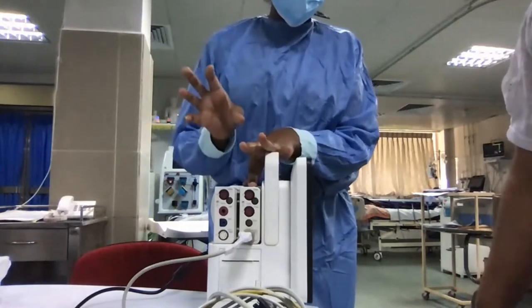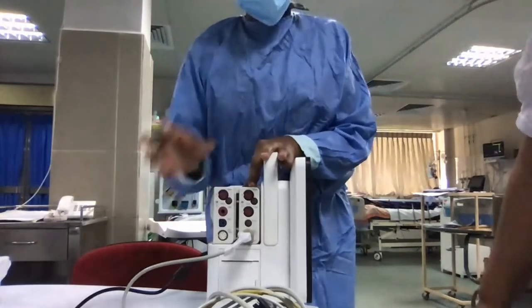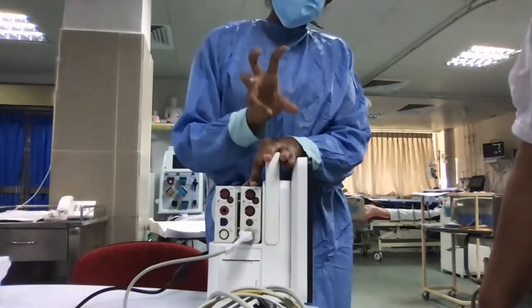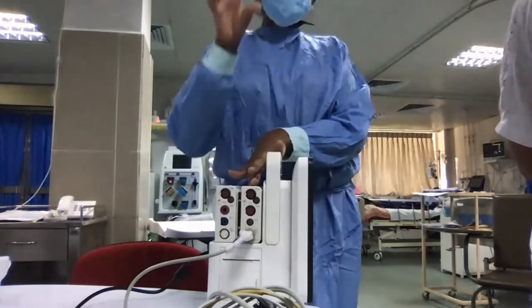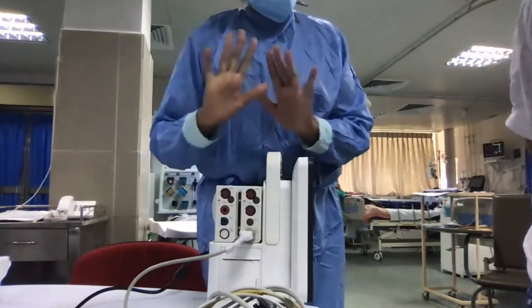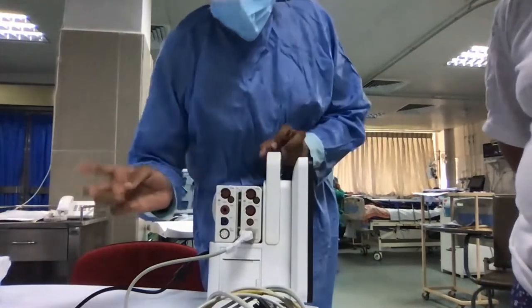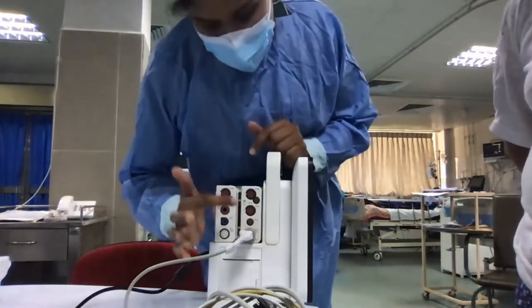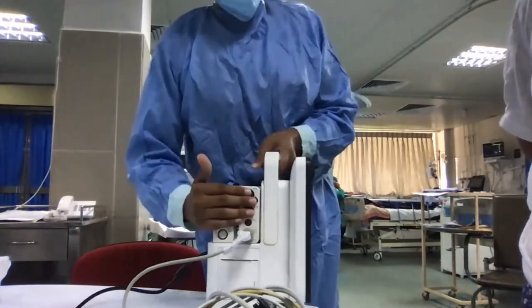But if you have seen the Philips MX550 and high-end modular type monitors, you get a very small module which can be connected to the monitor. So this is an extension that we call a small module. Anyway, whatever it is, you need to have a cardiac output extension or module. Then you need to have an arterial line as well as a CVP line. That is what we need from the monitor.